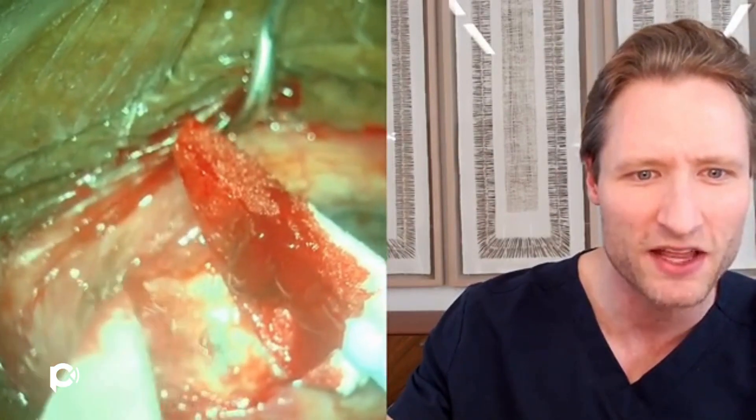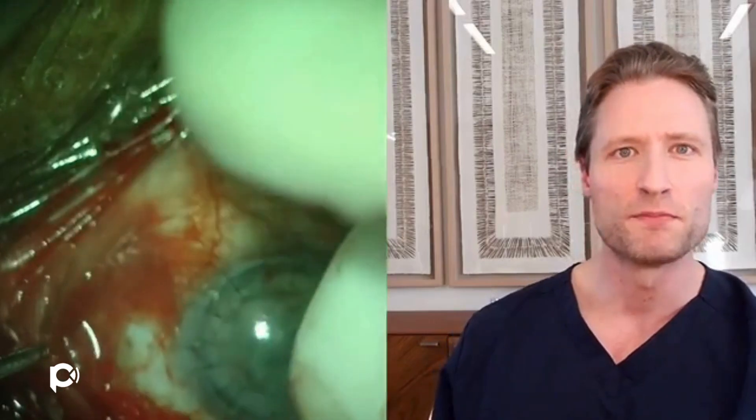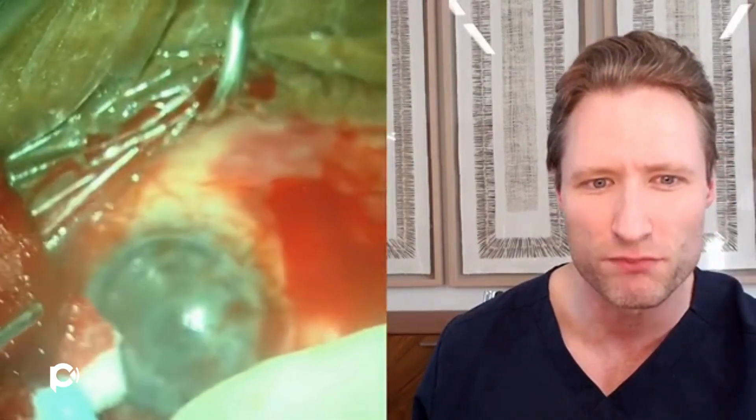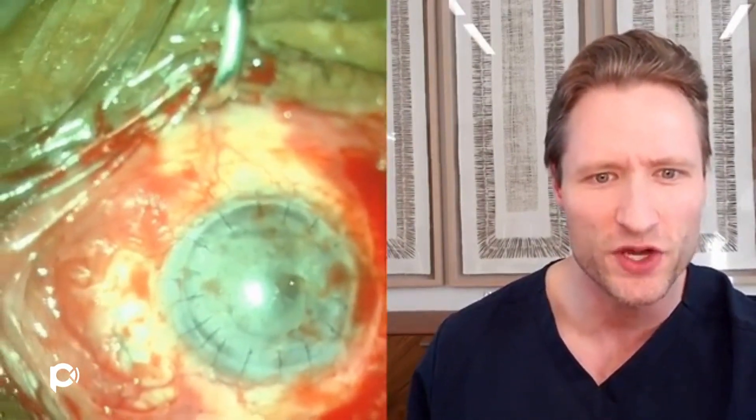I'm going to fast forward to show you the key maneuvers. There are a variety of ways to do a scleral fixated lens — the Yamani technique, and a variety of different suturing methods — but in this particular situation, I think a glued IOL is probably best. The reason is that by making flaps in the sclera and then sclerostomies, you can perform a vitrectomy through those sclerostomies without needing to blindly place ports through the pars plana. It's also nice to start with these scleral flaps because by decompressing the eye, it allows you to go into the anterior chamber and reform the AC.